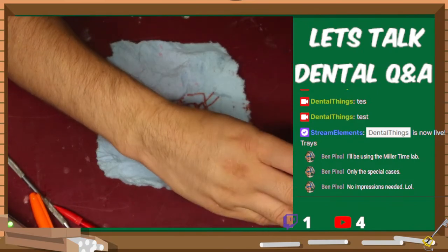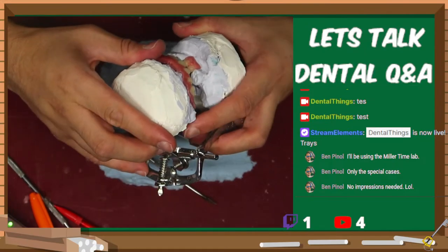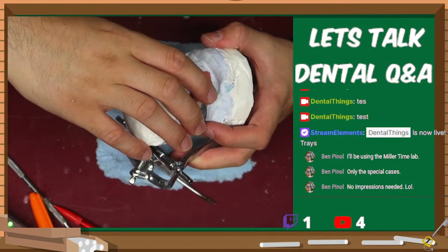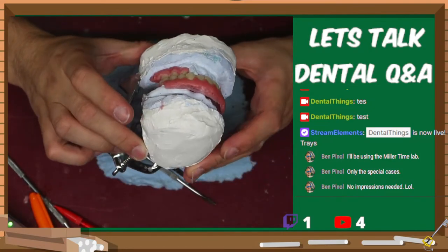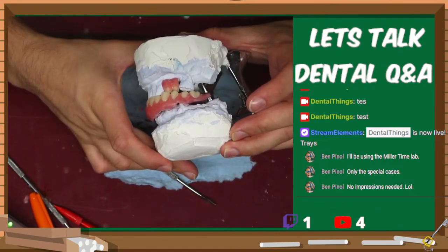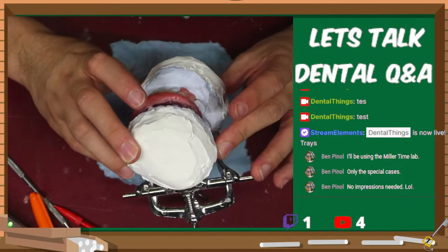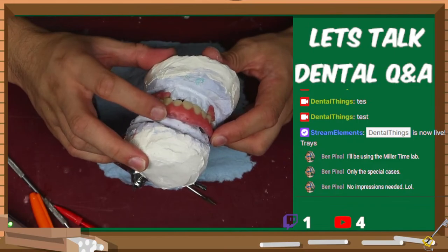But let me put this on my model. I'm going to check and see what I have here. With this patient, the issue I'm having is they want their bite end to end, which is dumb to me, but if that's the way they want it, I can make it just like so. And that will handle what I want to happen. And so I can make it work like this. This last molar on this side needs some help. It actually needs to be taken out and replaced, but we'll work with it and I'll replace it when it actually gets taken out. But this isn't too bad. I need to finish up the edges over here.